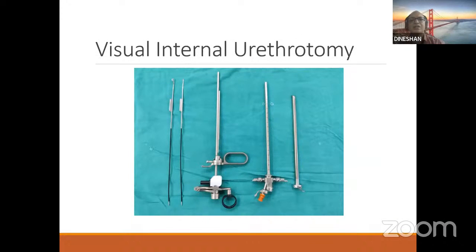Now coming to another important instrument, the visual internal urethrotome. It is used for two most important purposes: to divide strictures and for bladder neck incisions.